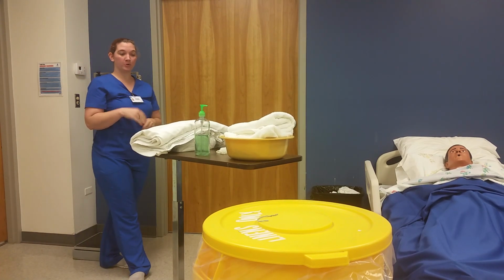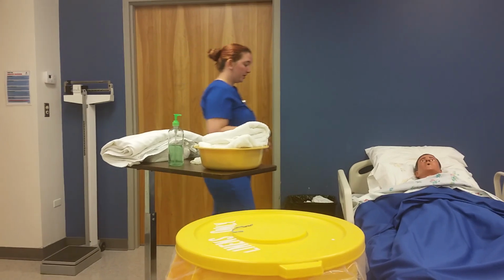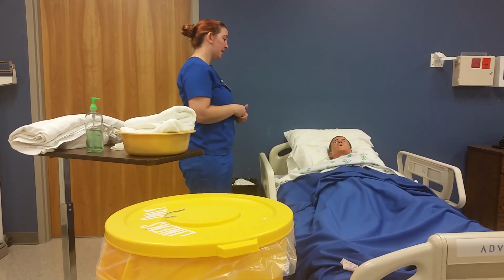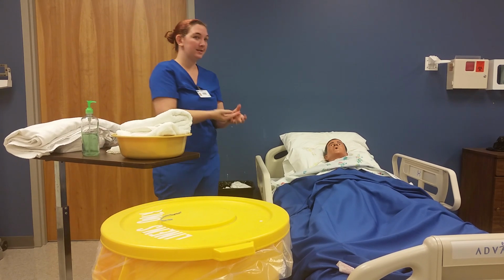I've verified my orders. I've made sure that this patient is the one that needs the catheter. I would come in, introduce myself. My name is Melissa Medina. I'm going to be your student nurse today. I'm going to wash my hands for 15 seconds.